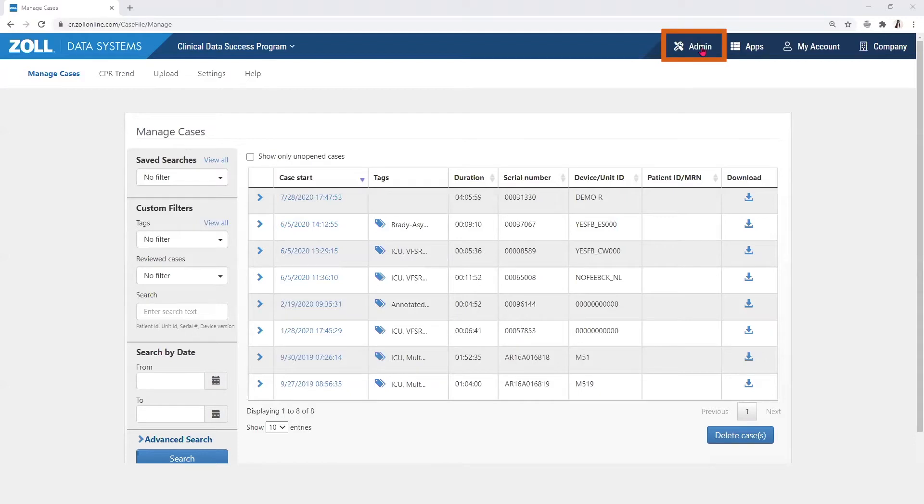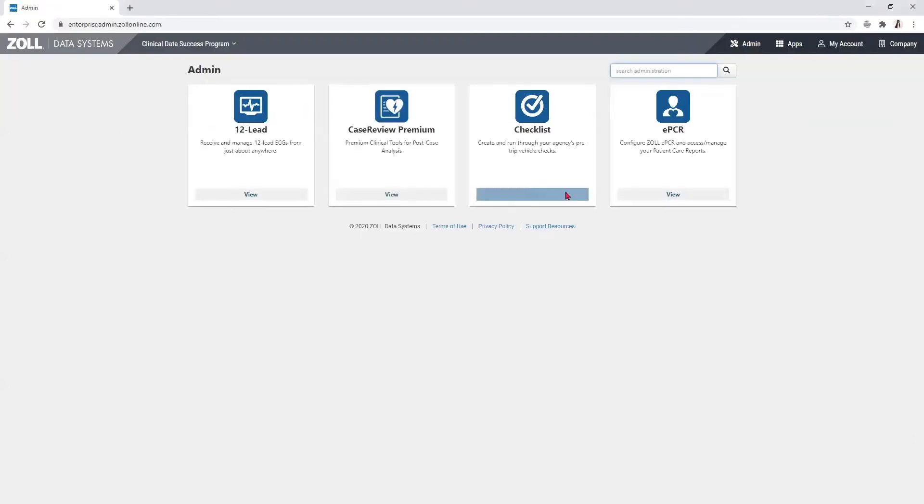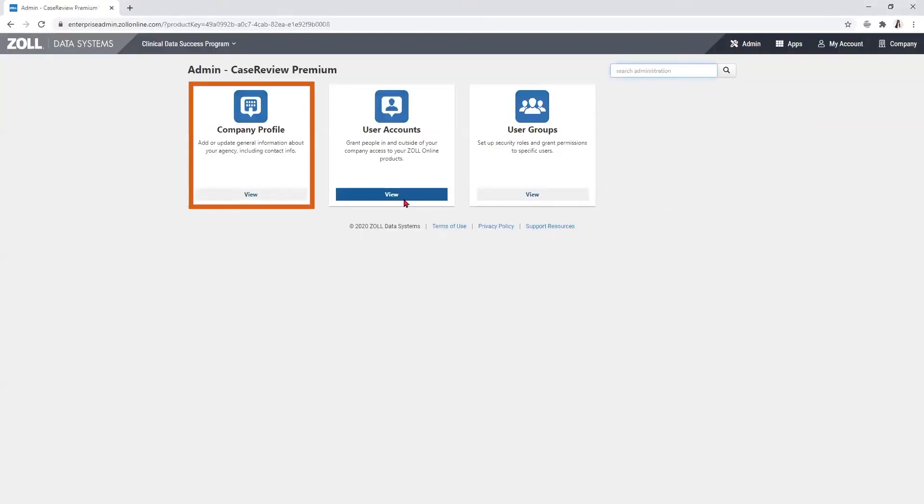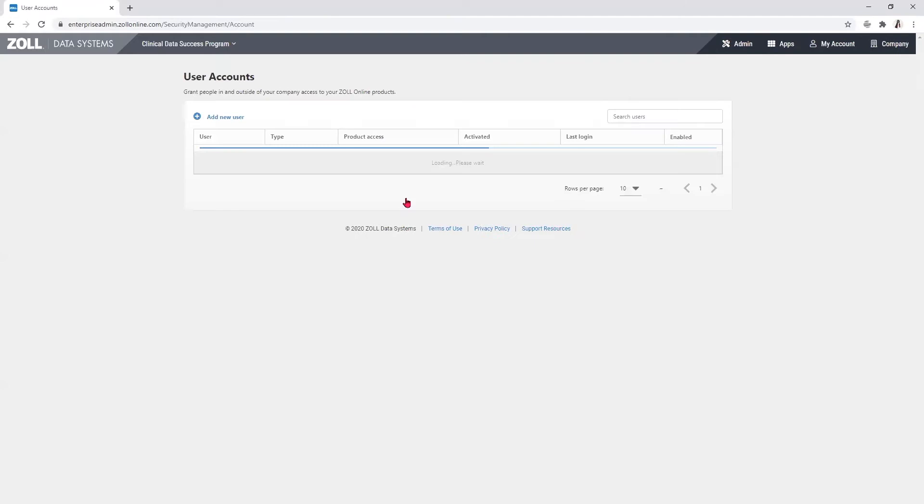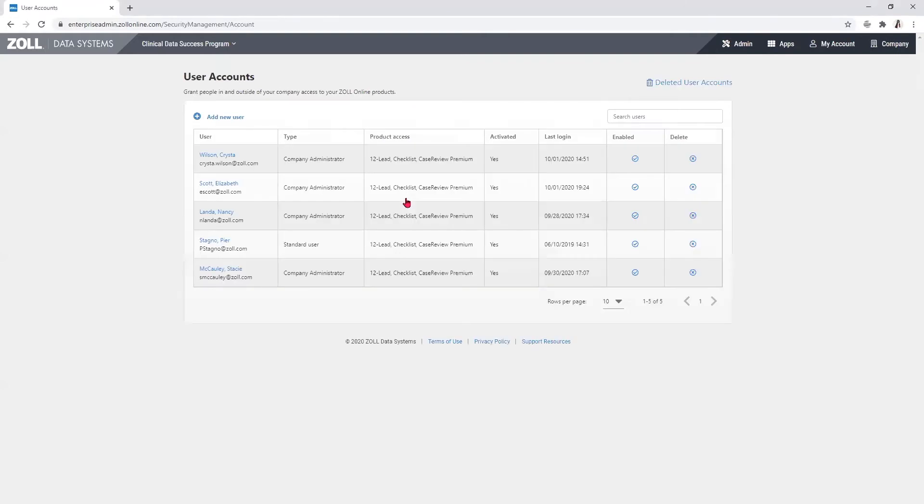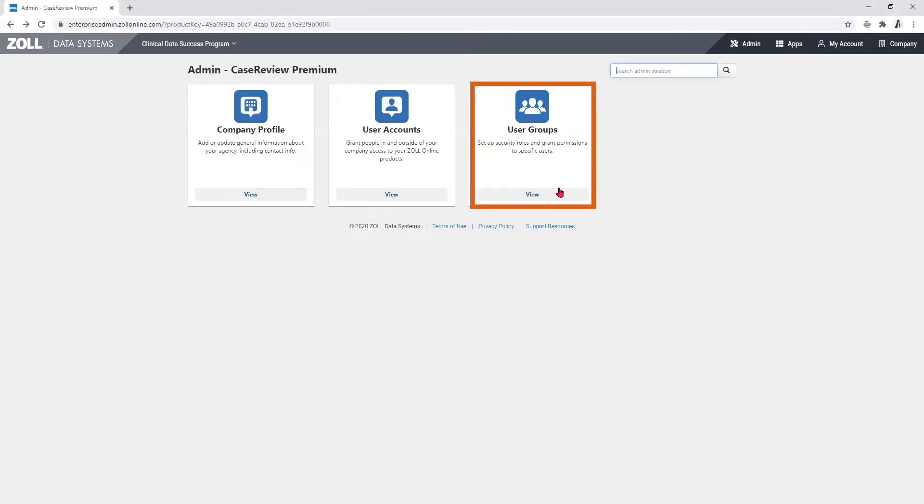The admin area includes the company profile for your facility, the user accounts for each individual who has access to the software, and user groups that allow the administrator to grant permissions to specific users.